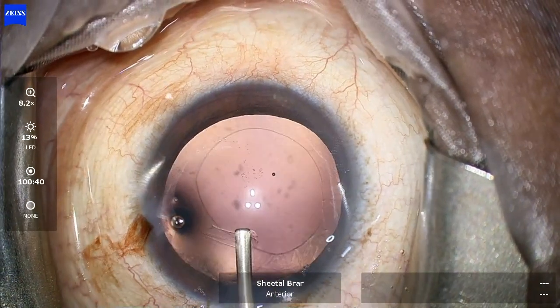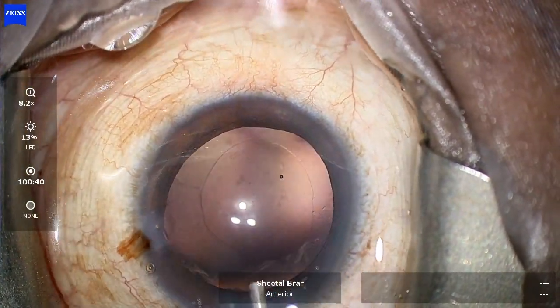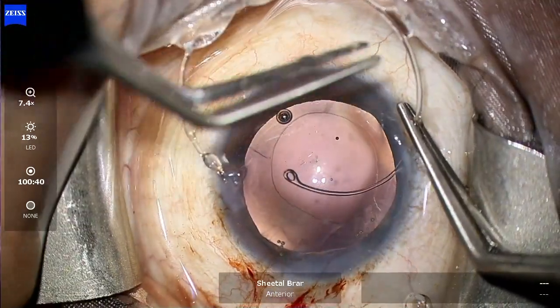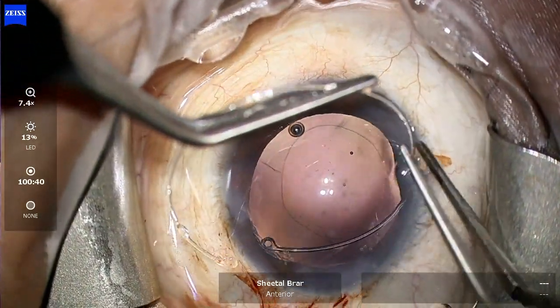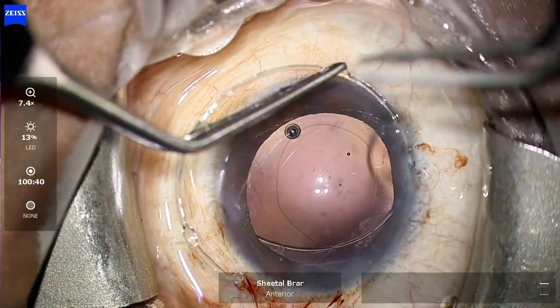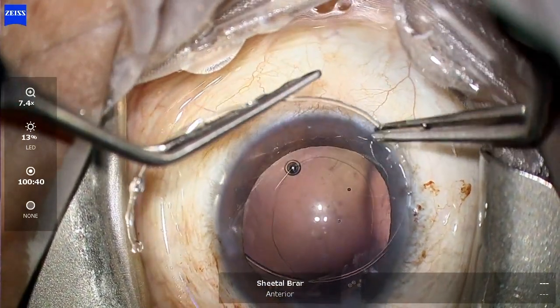The first thing I do is inject OVD into the bag and form the bag well. Fortunately, there is no vitreous, so I can go ahead with placement of a CTR. These cases of up to three to four clock hours of intraoperative zonular dialysis can be managed safely using a capsular tension ring, as I'm doing in this case.